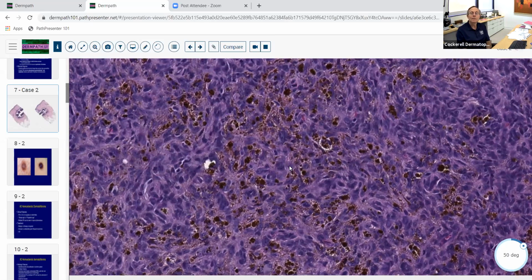And that's one of the unfortunate things about the computer, is that you can't, like with a microscope, take the substage condenser and rack it down, and see if this stuff is refractile when you look at it. If it is refractile, it's because it's a crystalline material refracting light, and that favors the diagnosis of something like hemosiderin. So if it's refractile and it's brownish like this, golden brown, that's hemosiderin.